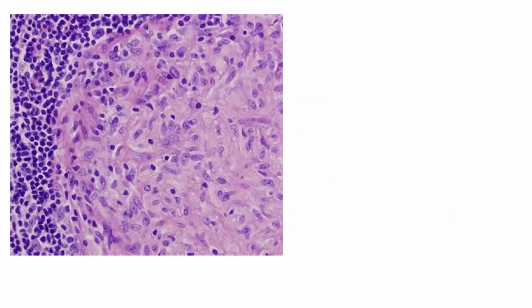Now, let's see which cell is which. As you can see, this makes a boomerang. A lot of epithelioid macrophages. Let's not get into theory, just the practical part, how you will see it under the microscope, because nobody cares about theory.